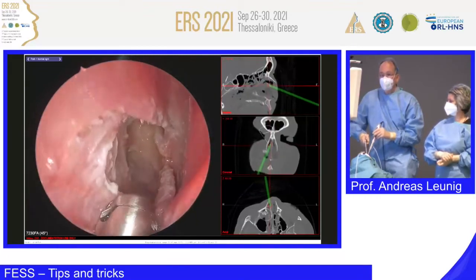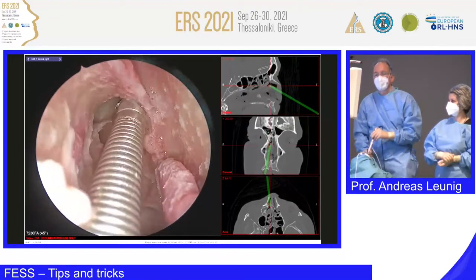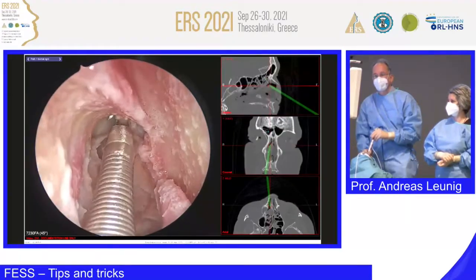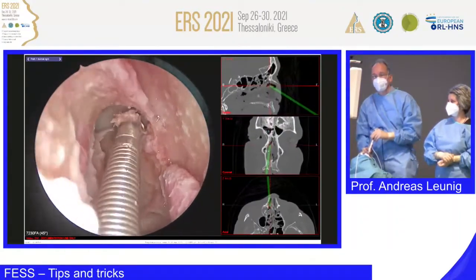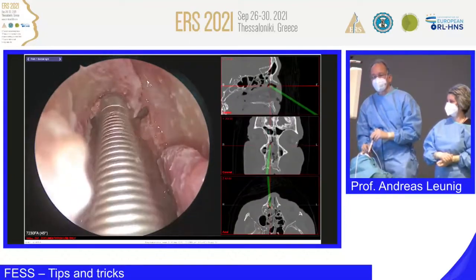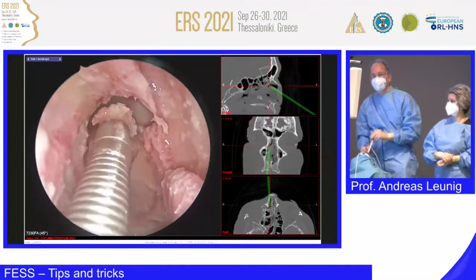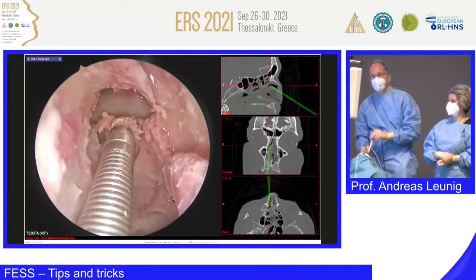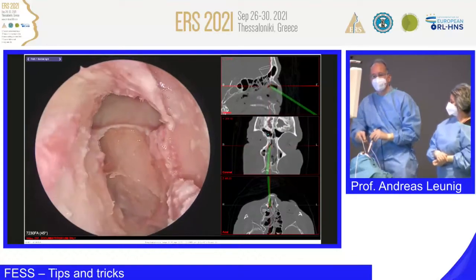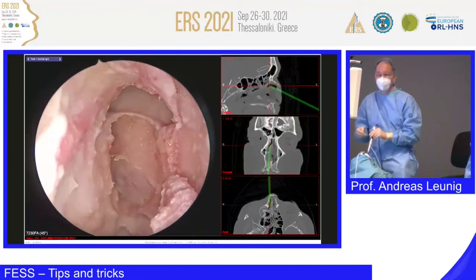Yeah, that's a good question. Yes, of course, I observe some flaps of mucosa, because when we drill the bone, we damage the mucosa. You're right. When you drill out and you don't open it widely enough, the risk for restenosis is quite high. I tried several cases using local treatment with the Propel stent, the mometasone-coated stent. Some patients did quite well, some did not. And when you have a tricky frontal sinus, you drill and restenosis comes again, it can be very hard. I have these cases.